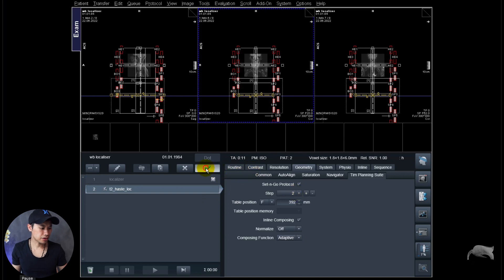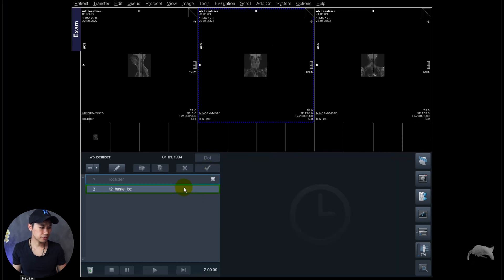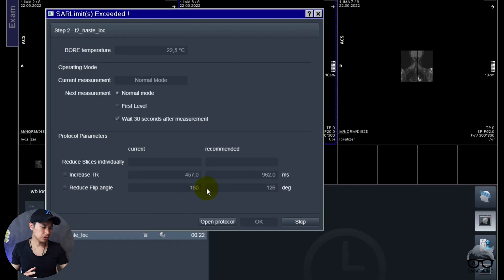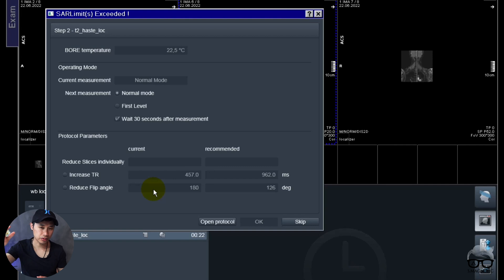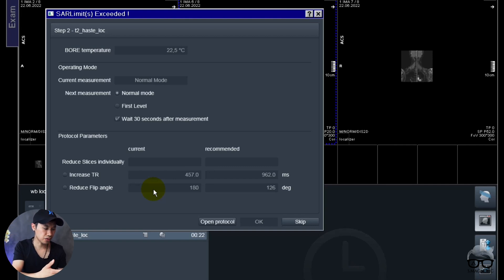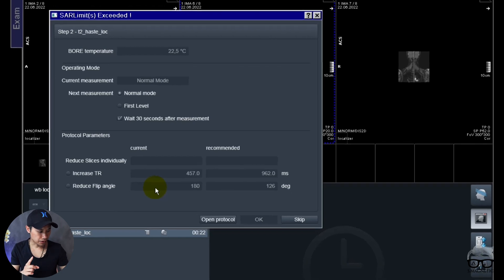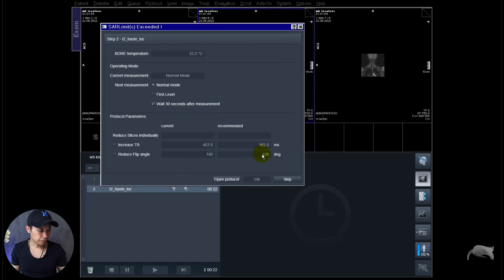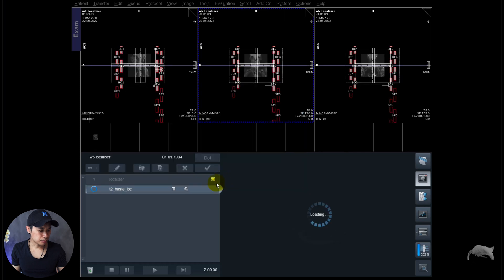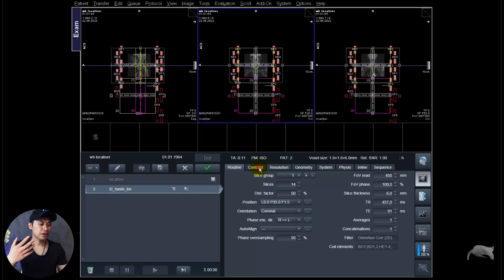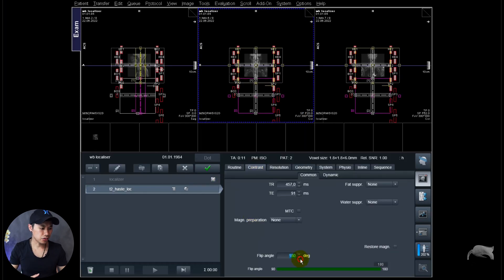So let's try to start this one, it takes 22 seconds. And of course you will have a SAR issue because you went from 1400 TR to the minimum which is in this case 457. You get SAR issues. That's one more step I want to do, just open protocol.